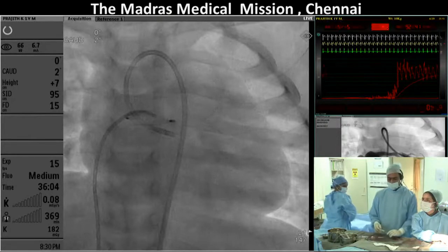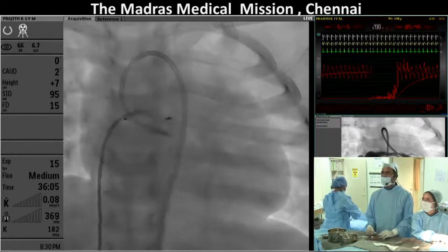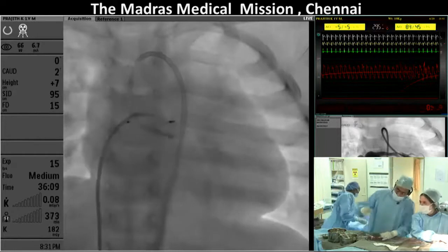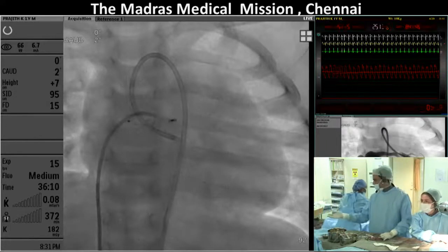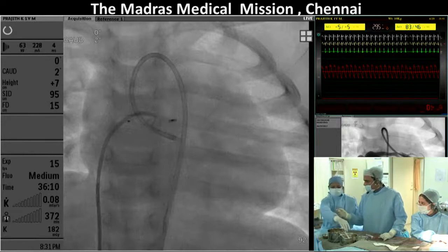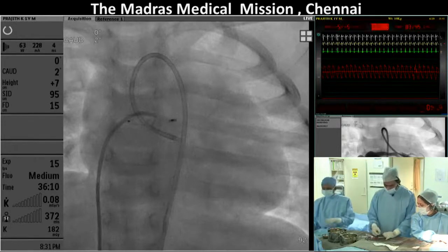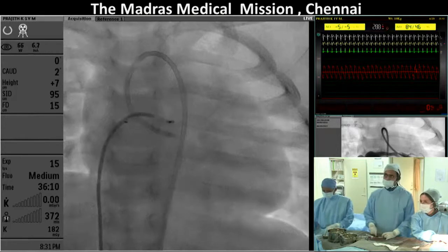Hold on, sorry. Mansoor has changed his mind about that 99%. I apologize. It's 60-40. You are right, Jim. That's right. In 1%, it comes from aneurysm and stuff. So that's different from 99%, isn't it? Warwick, you were saying, sorry, we interrupted. Just to say that you have 2 exits here, and then you're going to block 1, and what will you do with the next one? No, the bigger one. He's going to fill the aneurysm. That was the plan. Okay.